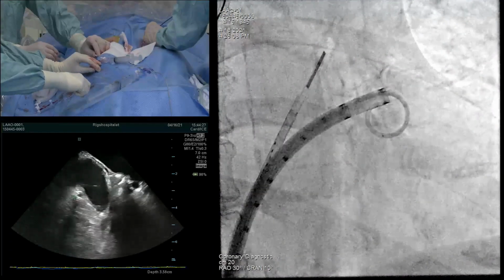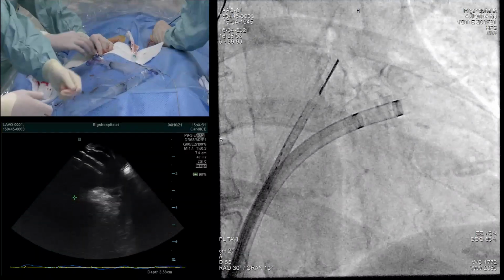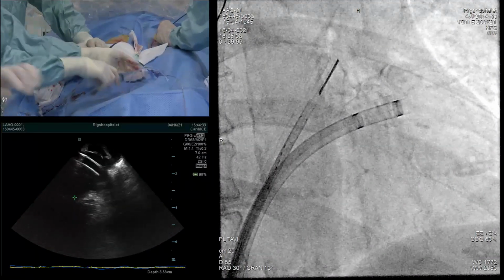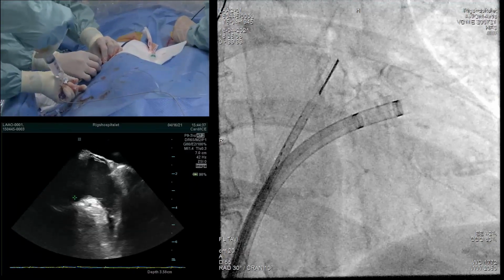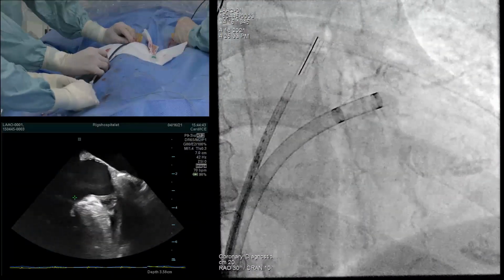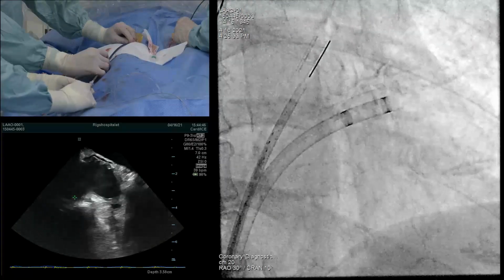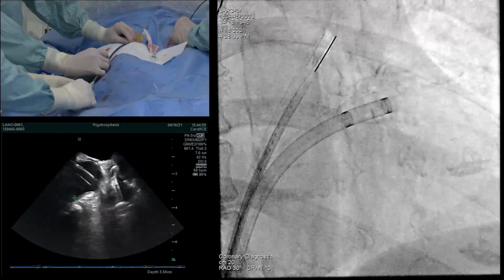Don't go without it. So we take the pigtail catheter with the standard J wire out. Let it bleed back. We take the white tube off, let it bleed back, make sure there's no air in it. And then on the cable, we push the device forward. So Niels, on ICE, how deep are we there? Okay, so we're not too deep. No.